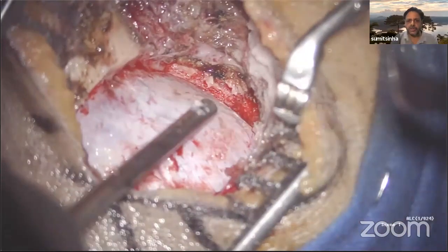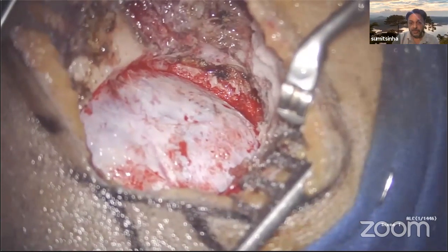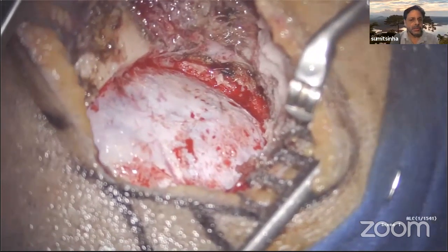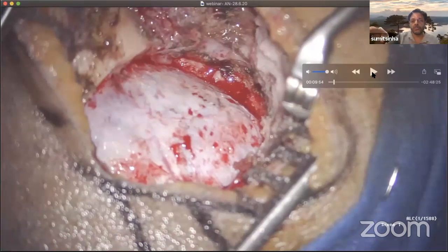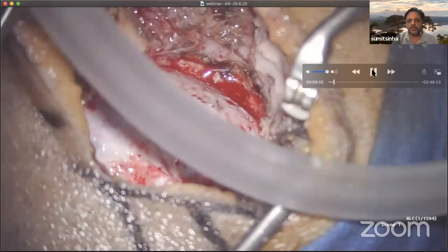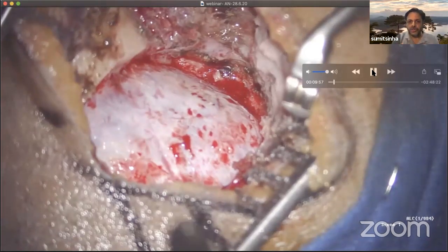There is no reason that you should remove the foramen magnum. Absolutely no reason. I have seen people removing the foramen magnum to expand the bony exposure, but in my experience there is no reason to open it. Yes, if the tumor is going down, or the tonsils are herniating below the foramen magnum, even in those cases you do not really need drilling of the foramen magnum. This is normal anatomy, and you have to learn to preserve the normal anatomy as much as possible and restore it.